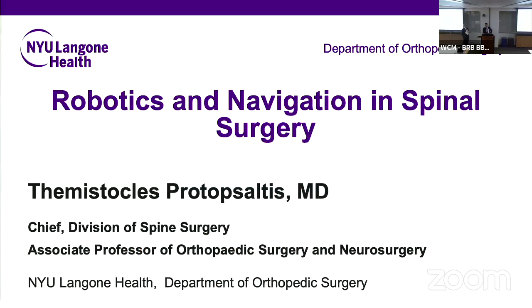I think it's very, very important. You'll develop almost a nervous tic the more you use it, of just checking. I'm always checking, kind of tapping on known landmarks, even if it's just MIS and deep paramedian incisions, you can feel TPs, joints, all the different things that you already know. And if that navigation looks accurate, you're accurate. And if not, it's time to reassess.